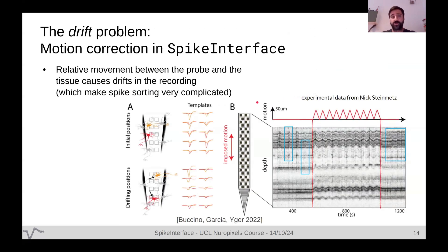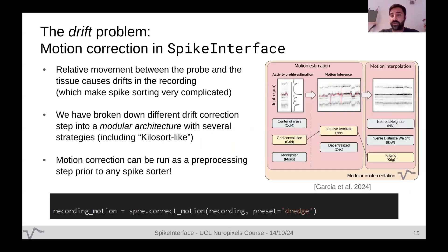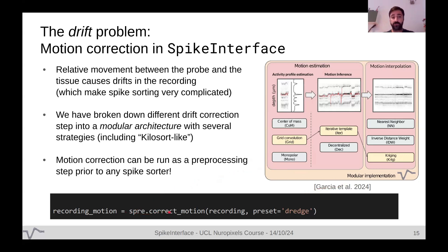Another big problem is drift — the relative motion between the probe and the neurons. Drift is a major problem for spike sorters because they assume that a waveform from the same neuron is similar each time, and drift violates this assumption. We implemented drift correction into a modular architecture in SpikeInterface. You can call correct_motion from the preprocessing module and get a corrected recording that you can pipe through any spike sorter.